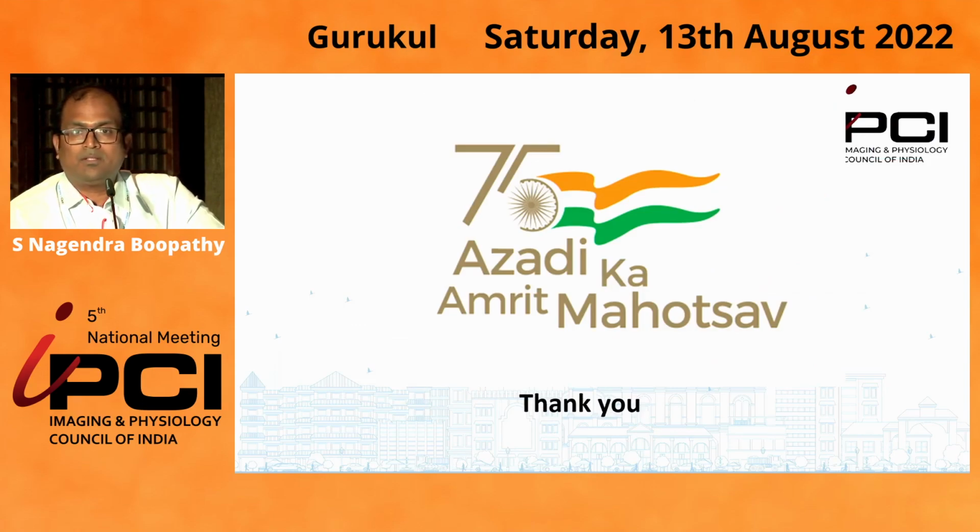So the strategy is very simple. DKCRUSH showed no evidence of increased benefit of an FFR-guided strategy. Clinically, hemodynamically, ECG-wise, angiography-wise, whatever data we are getting is enough to decide whether you need to intervene on a side branch or not. With this, I would like to conclude.